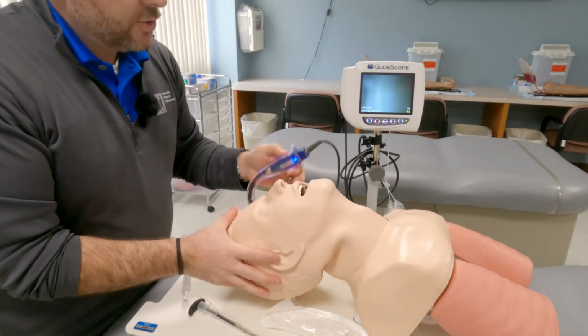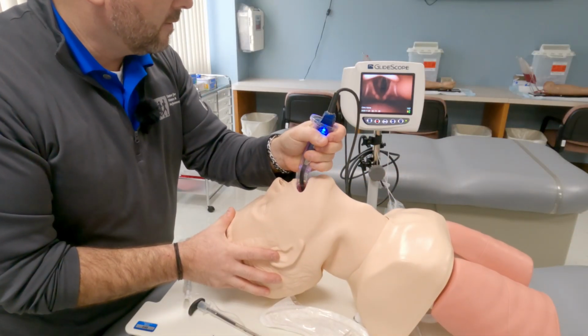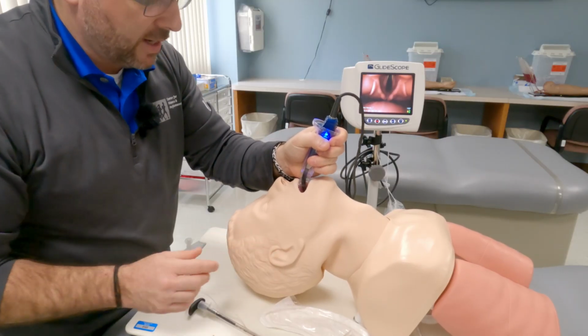First, number one, straight down the center. Grab it like this. Visualize the cords. So I lift it up, boom, wide open. You can see them right there.